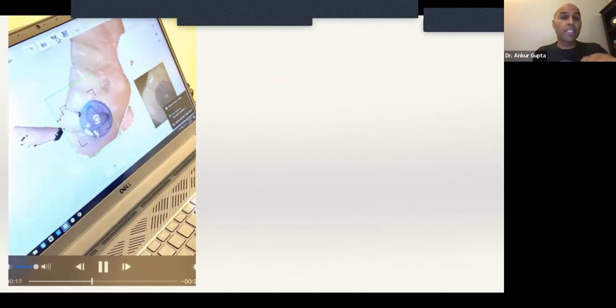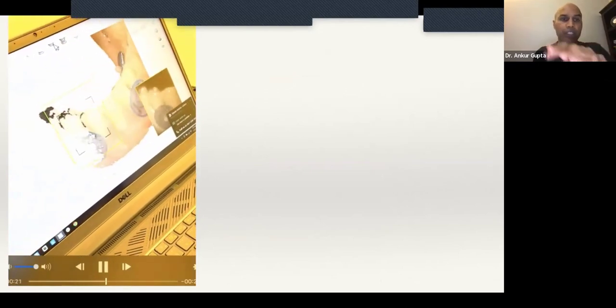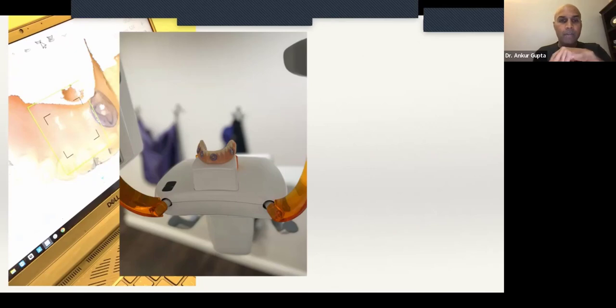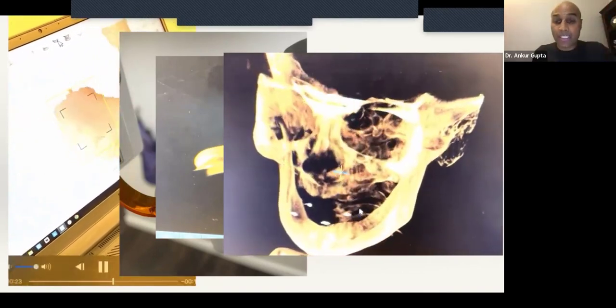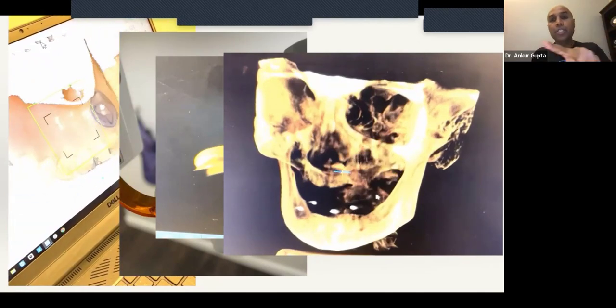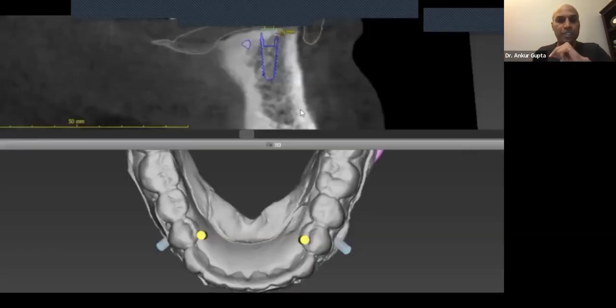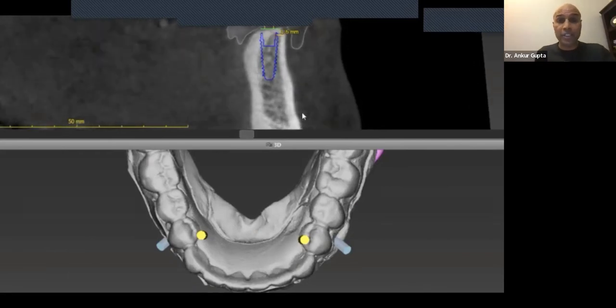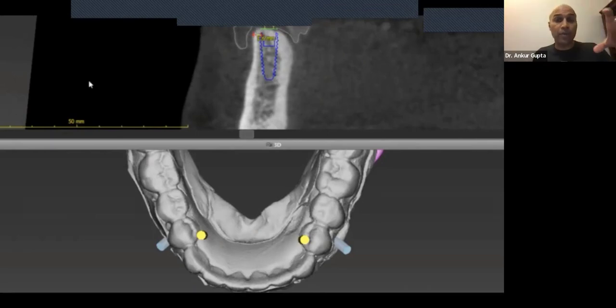If the patient doesn't already have a denture, you can have your lab make a simple record base, and then take a 360-degree scan of that with the stickers on it. You send your lab the scan and the two CBCTs. What the lab is then going to do is analyze the CBCT, analyze the denture based on those markers, and create an excellent surgical guide. That's what the CBCT of just the denture looks like — it's this image with some dots on it. Your lab wants that data to properly plan the guide.